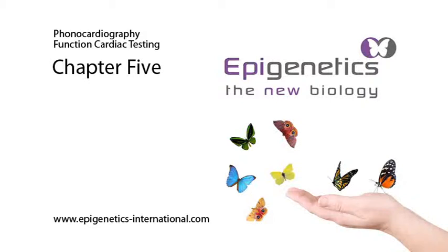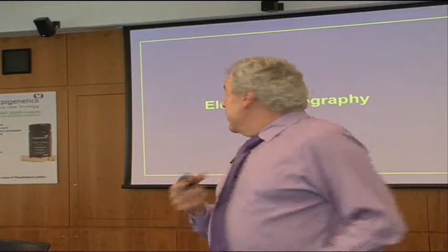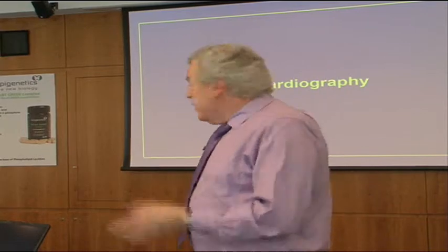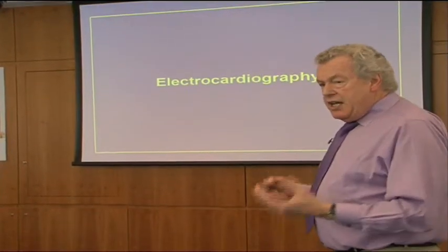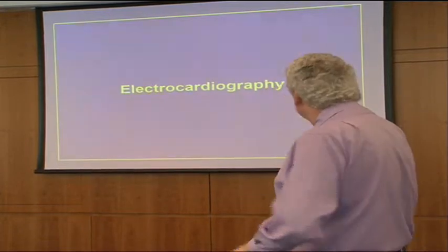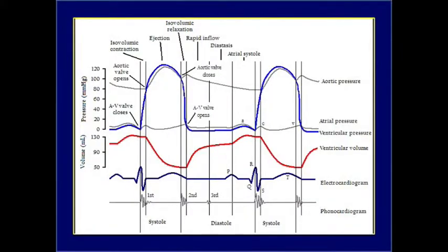So let's just now compare the phonocardiograph briefly with the electrocardiogram. Okay? The electrocardiogram, or ECG, is something which we hear about a lot. And the electrocardiogram is not something which shows us the sounds of the heart, it shows the electricity of the heart. So what happens here, if we go back to our first picture of this, with our heart sounds.